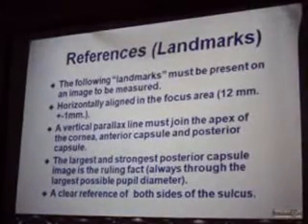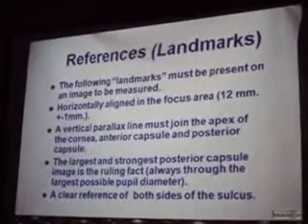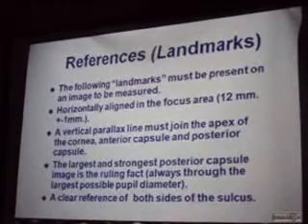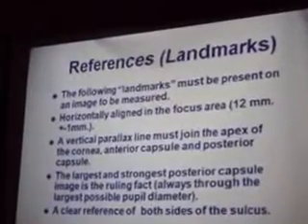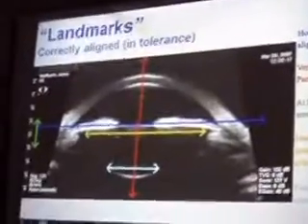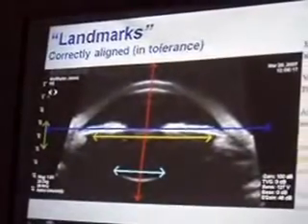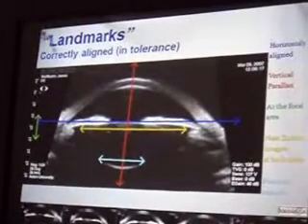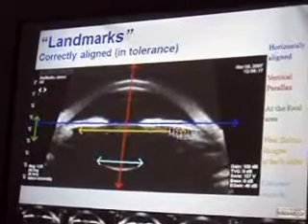That's what we call the landmarks, something that Dr. Hala showed before. Those are the landmarks, and let's go directly to the picture because here is text and it's boring. It's going to be a little more interesting to see that. What do we call the landmarks for alignment? The first critical one is you must be horizontally balanced.